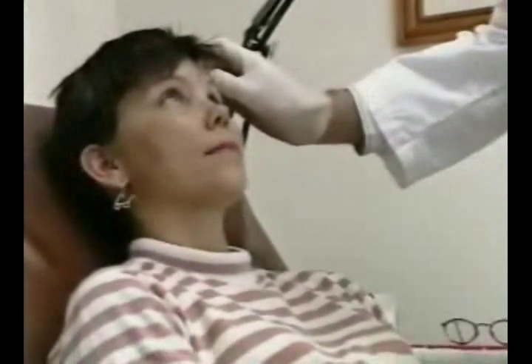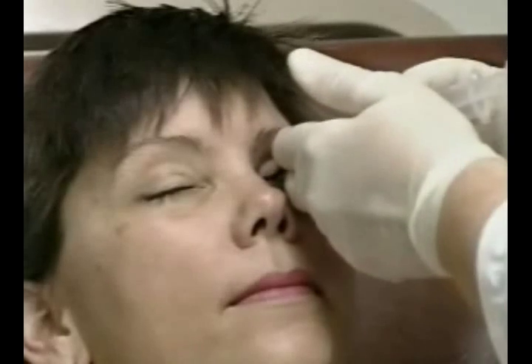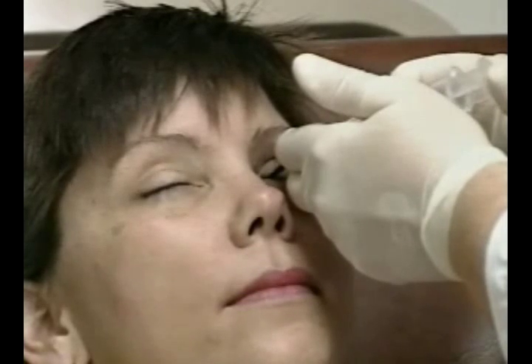As you are establishing a good relationship, your ocularist will feel more comfortable with your case, and addressing your particular situation will begin to take shape. There are several methods and variations to the fitting process. Your ocularist will describe their specific method step by step. The most common way to fit an artificial eye is to take an impression. A soft liquid impression material is inserted into the socket or over the remaining globe. Within a few minutes, the impression material sets into a gel which retains the exact size and shape of your socket. Taking an impression in this way usually takes less than 10 minutes.